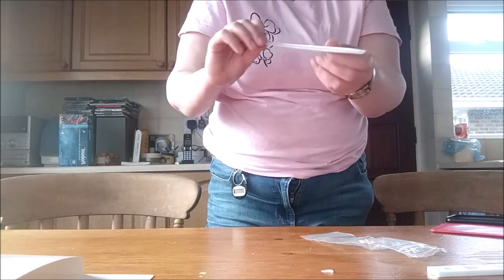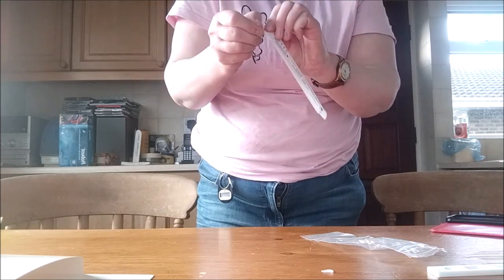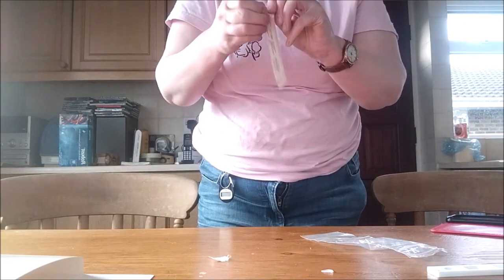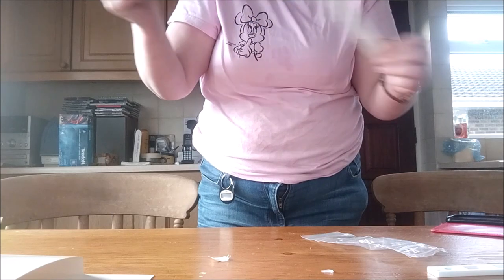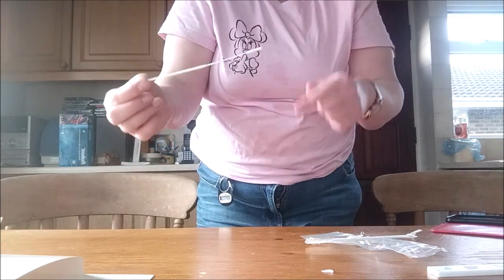Secondly, we're going to take the swab — try and get it from the right end. This is the swab. If you come with me, we're going to take a swab in the bathroom. It's easier just to do it in here. You open your mouth and you swab your tonsils, or as near as you can to it, as you possibly can.